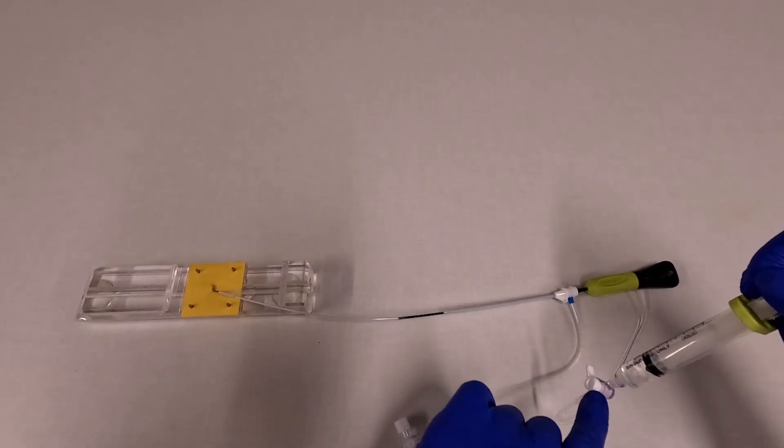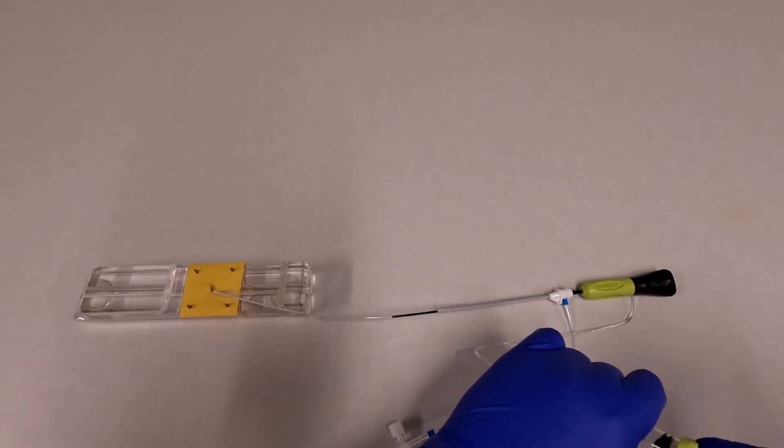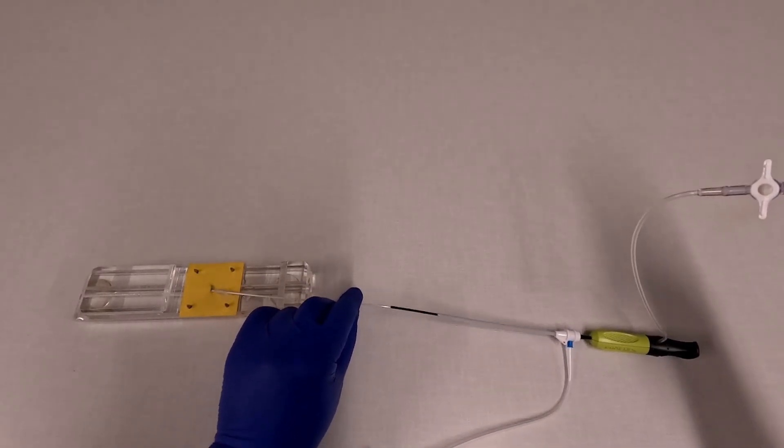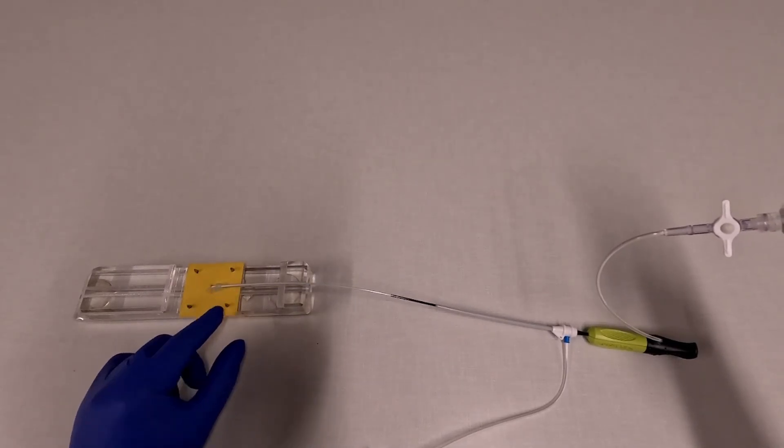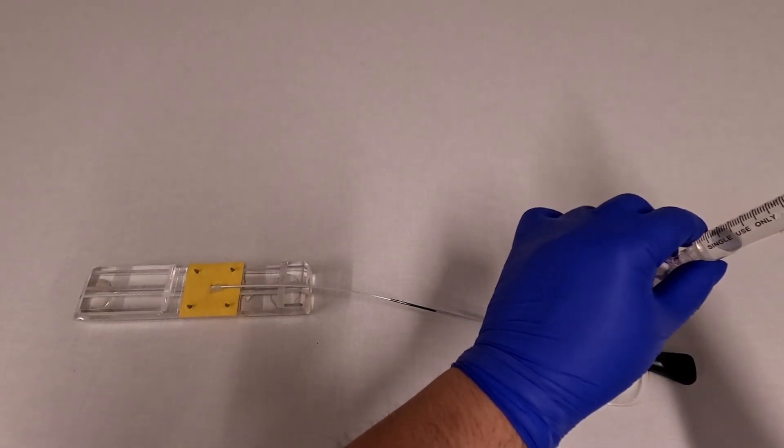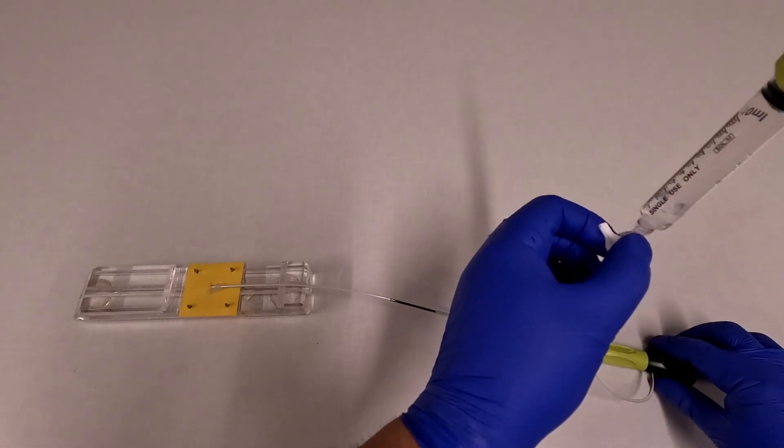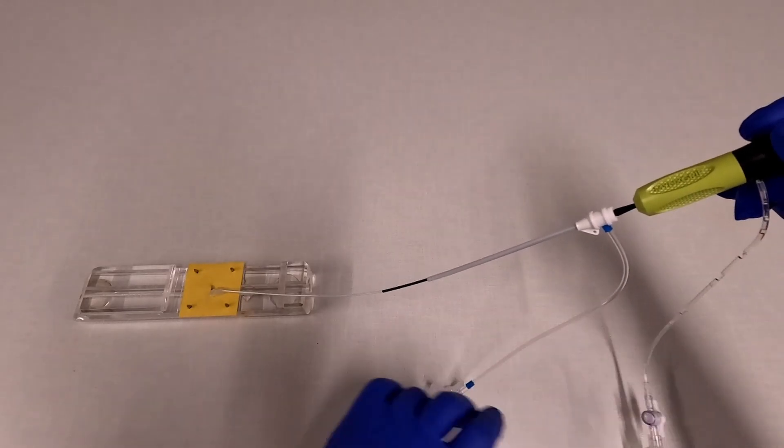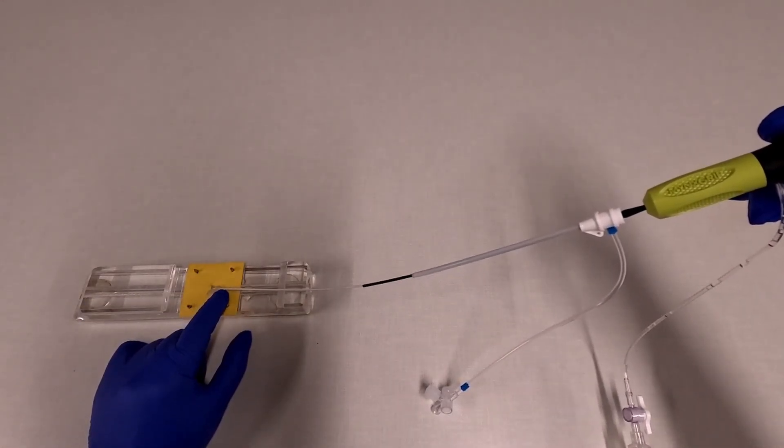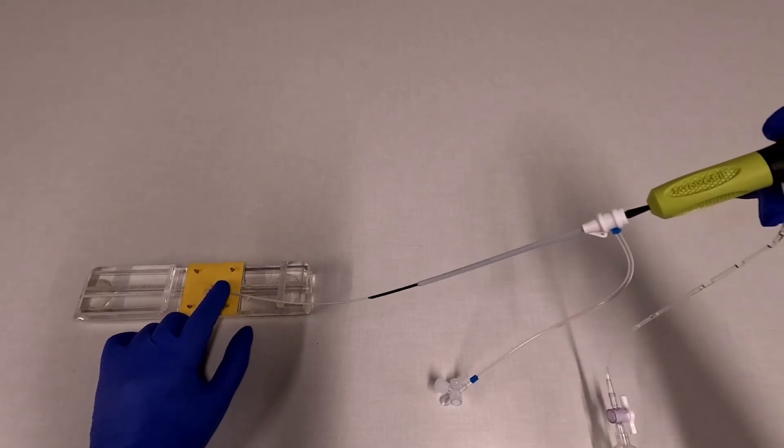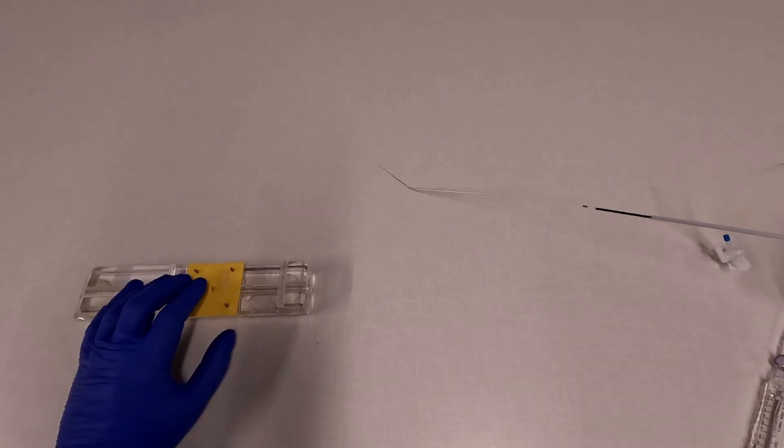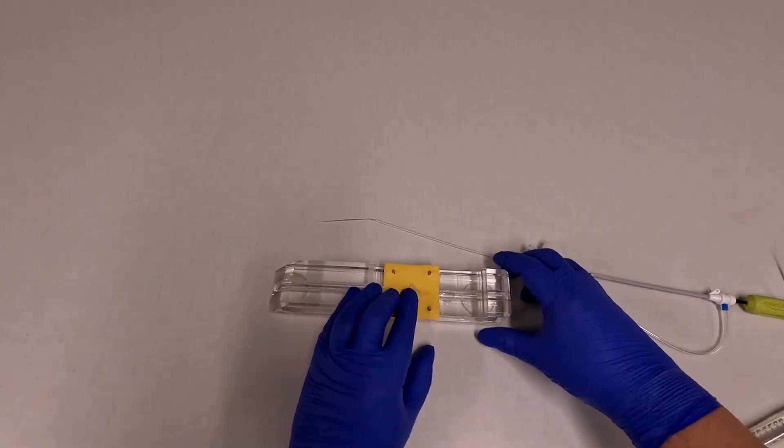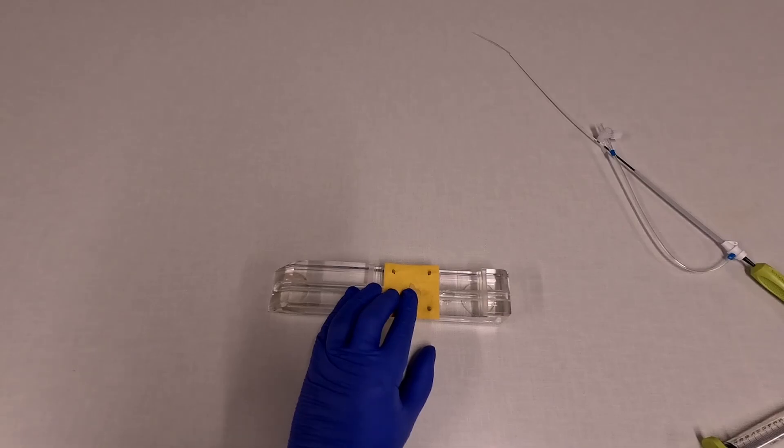So at this point, while keeping the stopcock closed, you're going to pull negative on the syringe. This just makes it easier for the next step. Now you're going to open the stopcock. This collapses the balloon on the inside. On this model, I have to hold pressure at the arteriotomy site, but in reality, you don't. It would be held by subcutaneous tissue. Then just pull the device straight out and hold manual hemostasis at the site for about one minute.